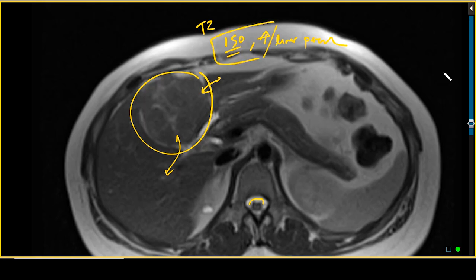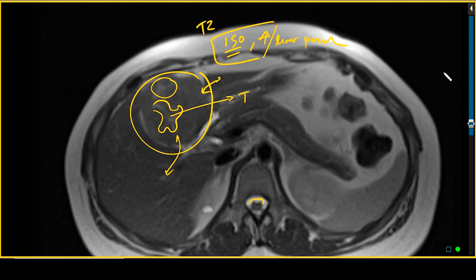Internally, we note that there are clefts within the lesion that are slightly more T2 hyper-intense. We'll get back to what those represent in a little bit.